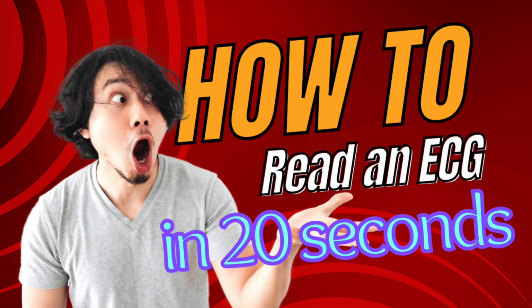Yeah. Okay, step 3 sounds a little more abstract. The heart's axis. Imagine holding a compass up to the heart. The axis basically tells us the heart's electrical orientation within the chest. By analyzing specific leads, we can tell if the electrical activity is leaning more towards the left or right side of the body. And is one direction better than the other?